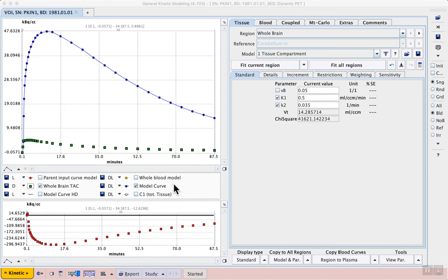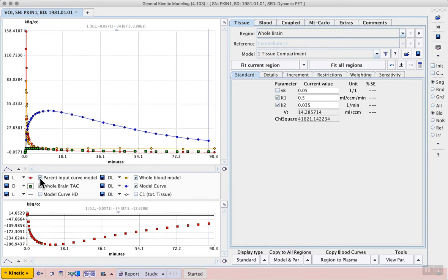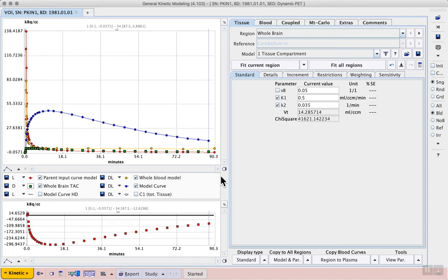To preview the blood data we can activate the checkboxes below the main curve display. We see both the whole blood data in yellow and the plasma curve in red. The whole blood data is still useful even though we have this gold standard plasma data because it allows the fraction of activity from the blood in each time activity curve to be estimated in the model.